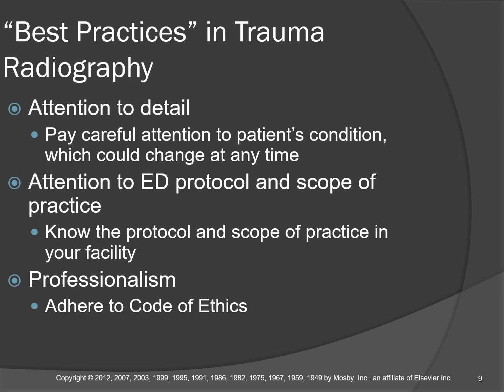And without even thinking, rather than saying, "Well, I need a deep breath," I just reached down and squeezed the bag, and then I shot the x-ray because I needed the lungs fully inflated. I didn't really take over the job. The respiratory therapist was still there. I just did one inspiration so I could get full lungs.